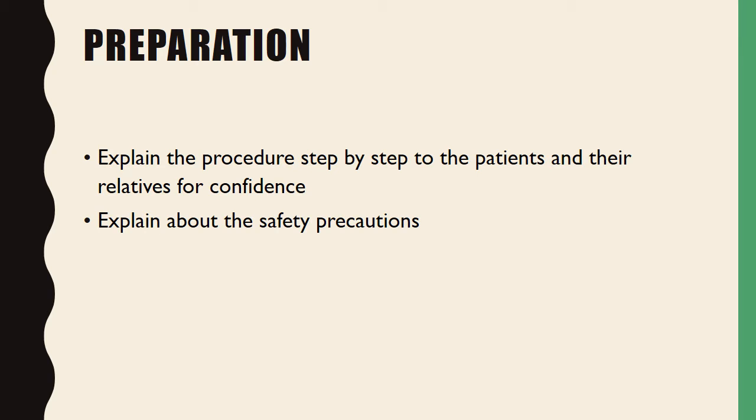Next is the preparation. As preparation, we have to explain the procedure step by step to the patient and their relatives for their confidence, and explain all the safety precautions, the main precautions related to oxygen therapy.